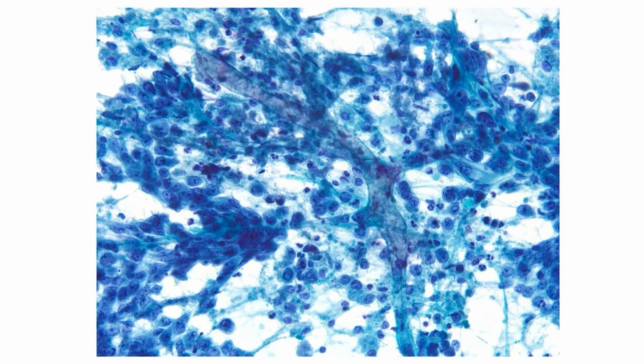More? Okay. So the Pap stain shows you vascularity. So you can see the hyperchromasia in the nuclei. Once again, vesicular chromatin, which is defined as an open chromatin pattern, in the background of which you have gigantic nucleoli, right? Beautifully seen here. Some suggestion of necrosis or karyorrhexis. And again, you can see the presence or absence of colloid, amyloid in the background. Enough or more? Enough. Let's see more.